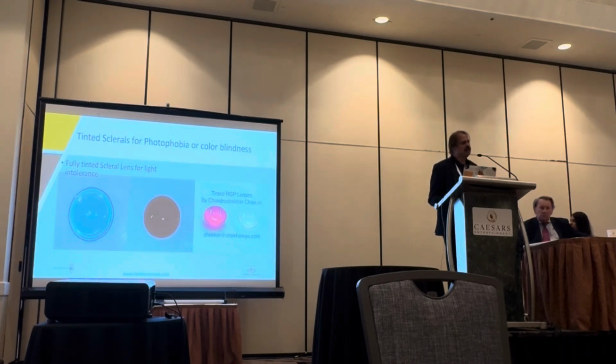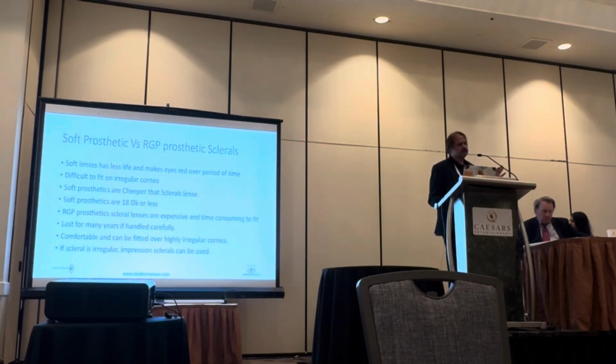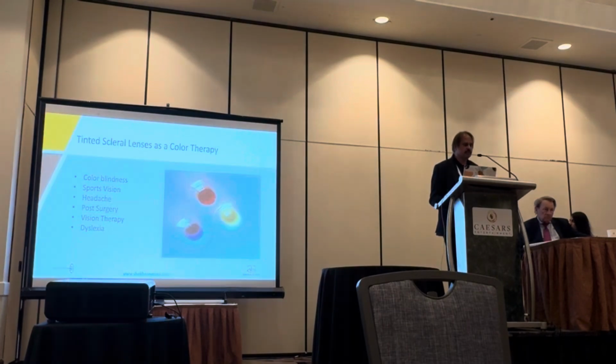You can have a mild to darker tint for various reasons. And this is one patient who was a normal patient, but so annoyed with so much redness because of the dry eye. He had tried everything possible. Ultimately, we made an opaque sclera and a normal clear iris in these patients. So just a comparison of soft prosthetic, because we have been fitting soft prosthetic for many years. It works fantastic, but if there is an irregularity on the cornea, and when you want to put a scleral lens to improve vision, this is the choice you have, and it can help with so many other conditions.